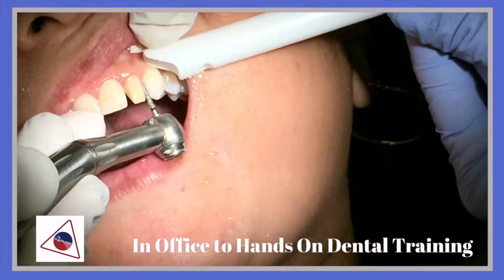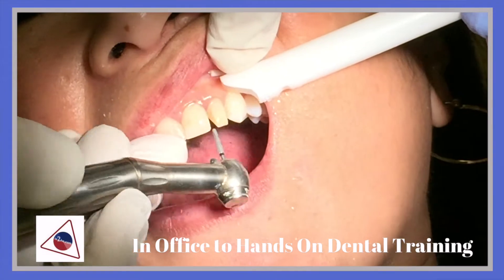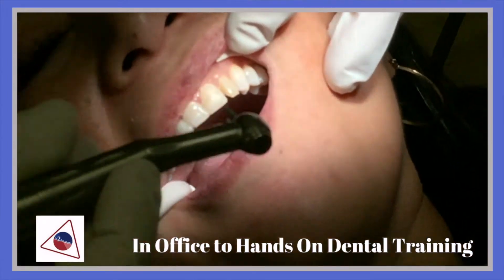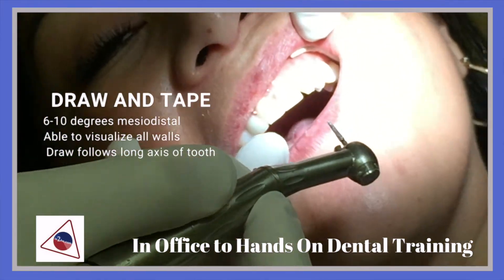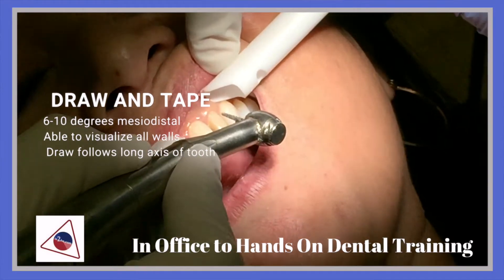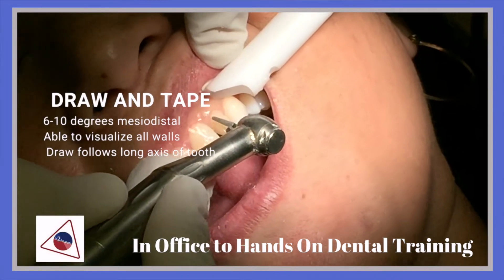I've got the distal side and the mesial side that I've been working on. I'm going to go ahead — I've got the distal and mesial side. I'm going to be working on the buccal margin, making sure that I have a draw and taper.